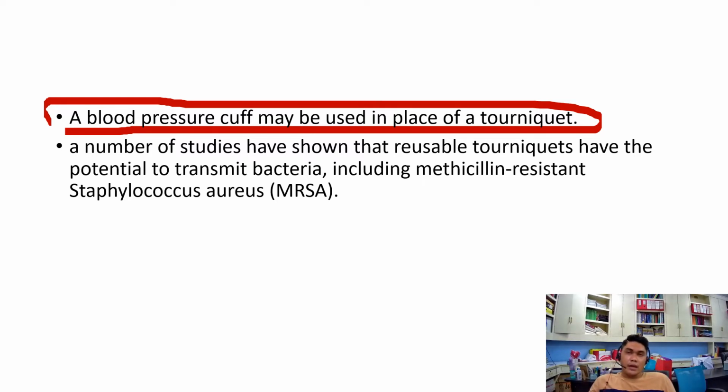That's why many laboratories reuse their tourniquets, disposing of them once contaminated with blood, but otherwise reusing them. Still, there's a possibility of transmission of methicillin-resistant Staph aureus due to reuse of tourniquets. Institutions or laboratories have an option to reuse or not, but it's up to them.